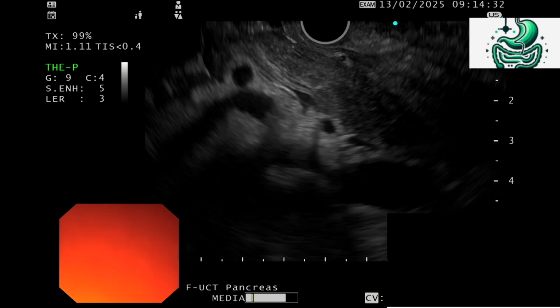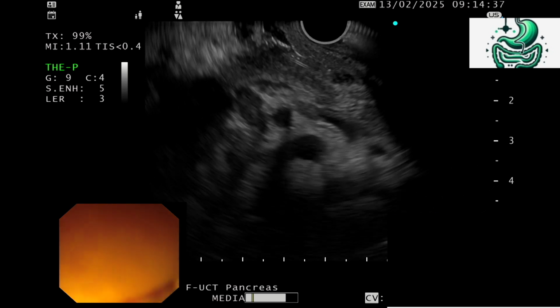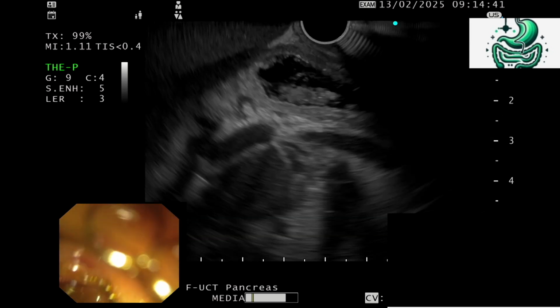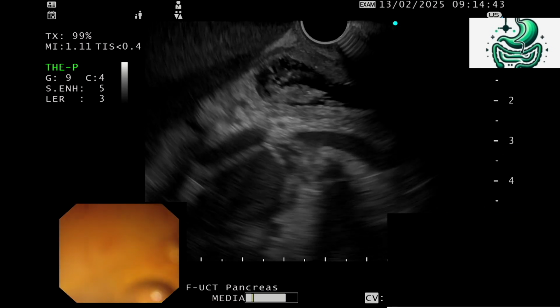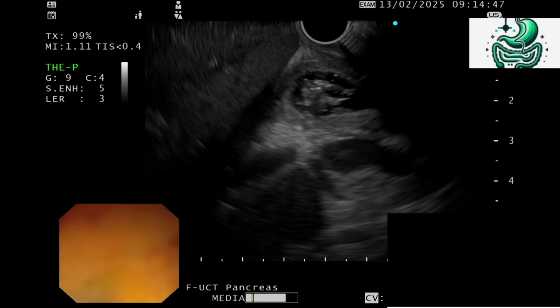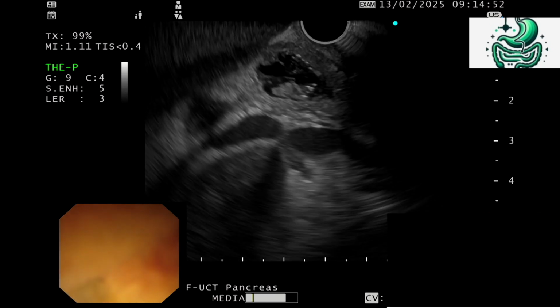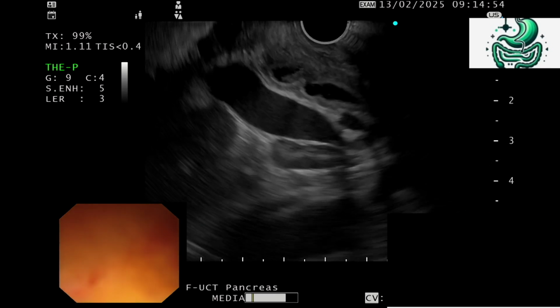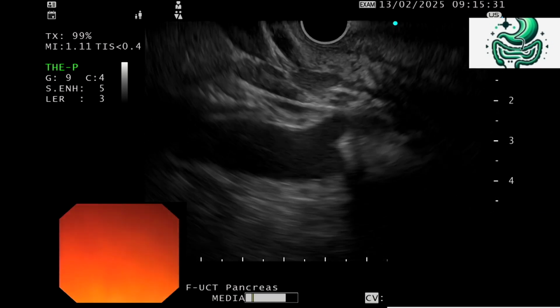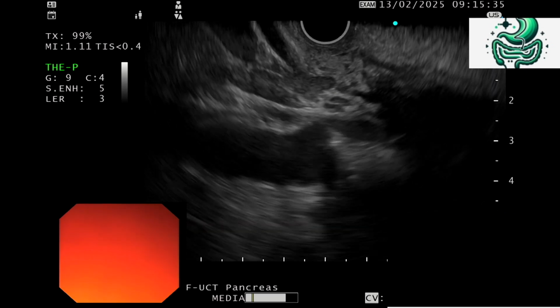The autoimmune disorder, that is IgG4 disease, has also involved the bile duct, causing its thickening, but there is not much dilatation in the middle. And as we come to the intrahepatic part, there is no intrahepatic ductal dilatation. So this is a sclerosing variety of cholangitis affecting the bile duct and also the pancreatic duct, very classical of autoimmune disease.